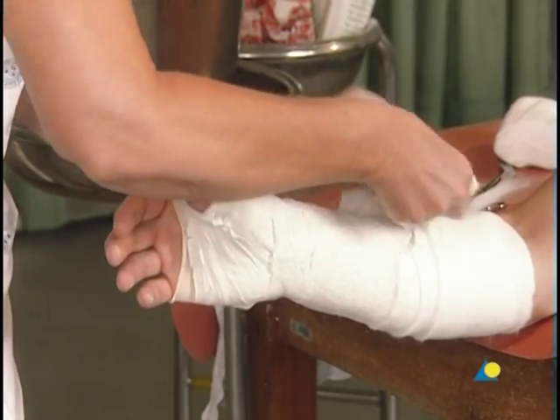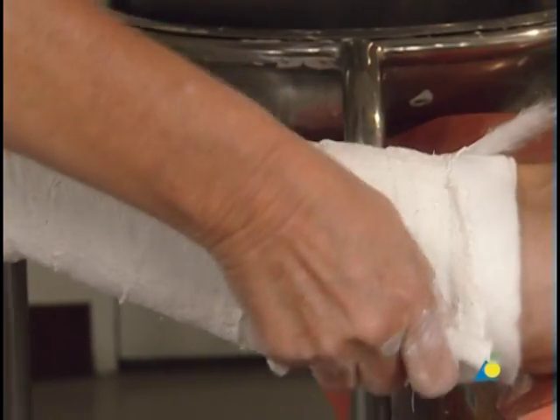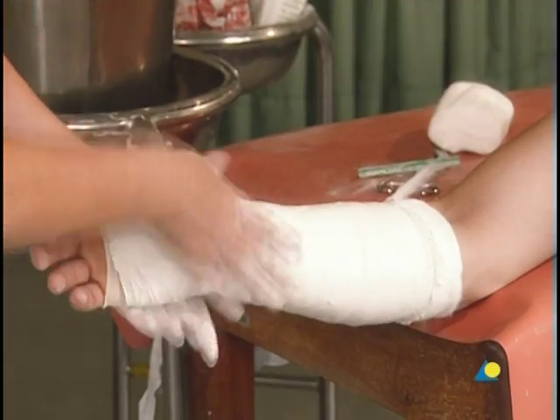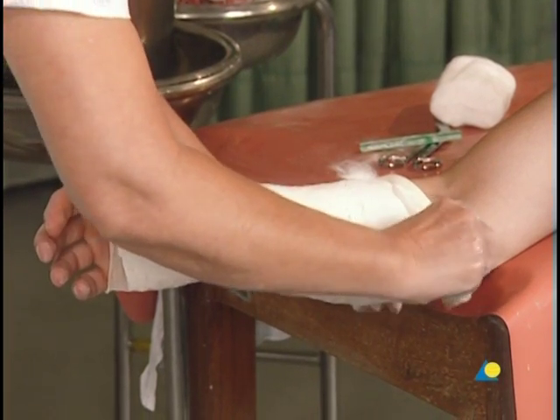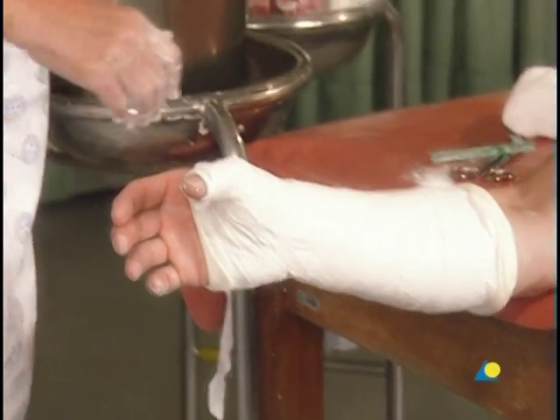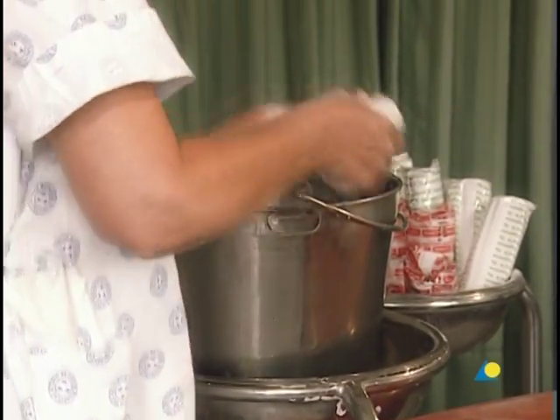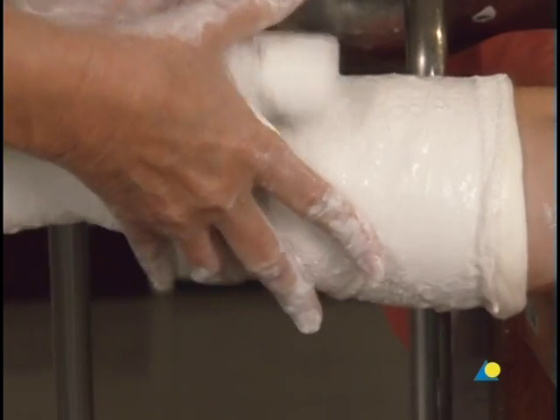The bandage is then gently rolled on towards the elbow, giving an overlap of 50%. A slight amount of cotton wool at the ends of the cast remains uncovered. The stockinette is now folded over the cast at both ends. A second plaster bandage is applied, beginning where the first bandage ended, to ensure a uniform thickness of the cast and to secure the loose ends of the stockinette.